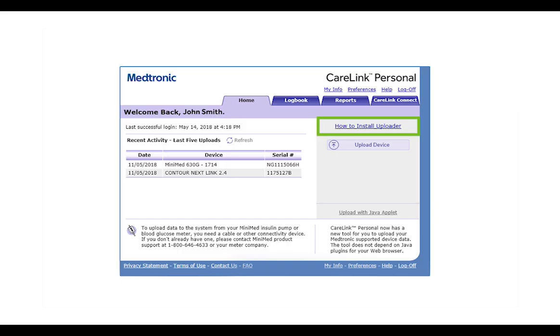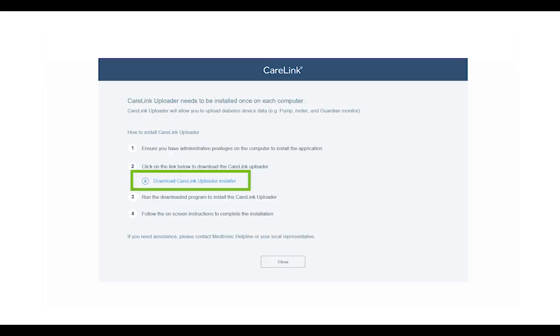The first step is to sign into the CareLink website and click on How to Install Uploader. Then, click the download link in step 3 to save the file to a folder that you can find, like your downloads folder.